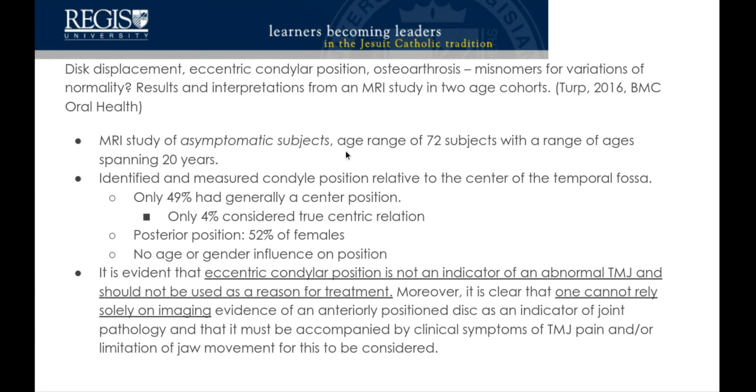So when it comes time to imaging the TMJ itself, this is a lot like other imaging in the spine, where there's a lot of disagreement between what normal is and what normal isn't, and the fact there's a lot of changes in the spine that occur over time that are really considered normal, although they come up as a positive finding on imaging. We've seen this a lot in the lumbar spine and the cervical spine, and it's true here for the TMJ itself.